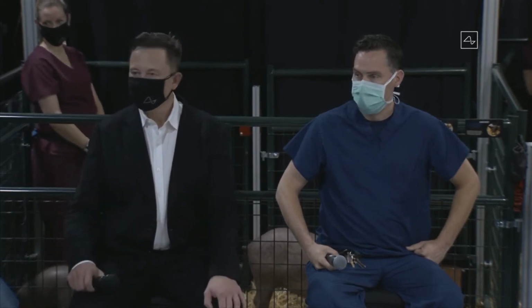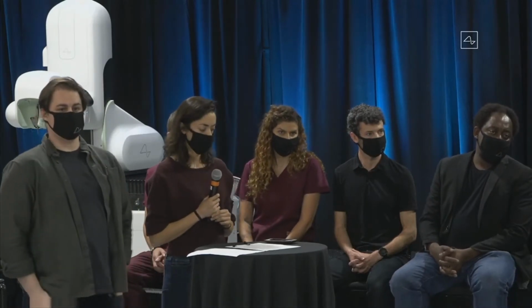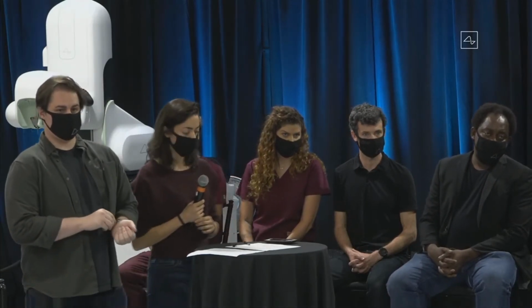Awesome. Ian, did you have anything to add? The robot is designed, the full length is like 7 or 8 centimeters. Yeah, so right now we're designed for like 6 millimeters. The actuator itself isn't actually limited to 6 millimeters. It can go much deeper.